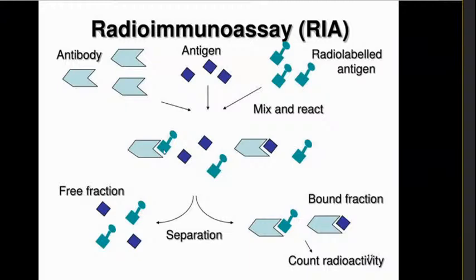It has a structure, right? Here they added the mixture and gave some time for reaction. After the reaction, we remove the excess molecules, separate the molecules, then collect the bound molecules based on their density variation. Antibody alone shows some molecular weight. Bound with the radioactive molecule and antigen, it gives a different molecular weight. It varies between the native and the bound compound.